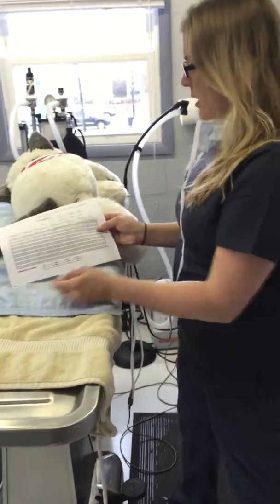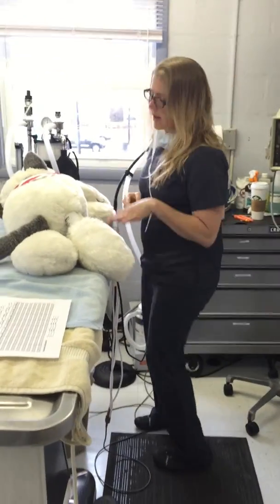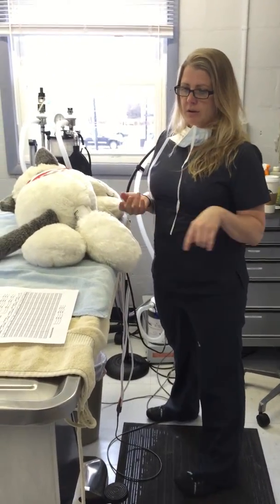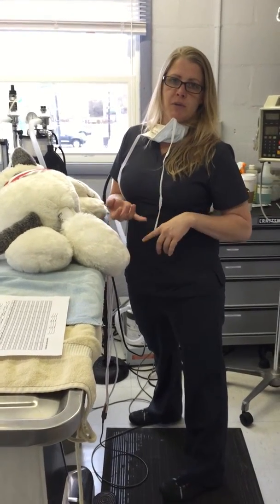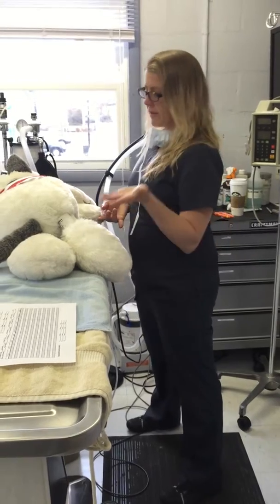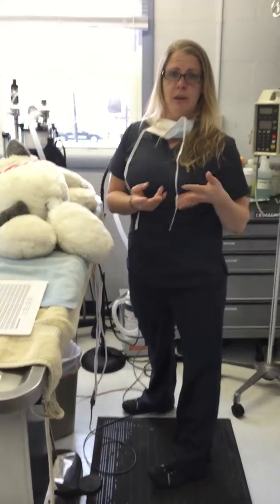with the patient. So when I first come into a procedure, the first thing I want to do is ensure that I have a good heart rate and a good respiratory pattern. The reason the heart rate and respiratory pattern are important is because if they have a high heart rate, they could be a little bit light, which is not going to be good for a procedure.